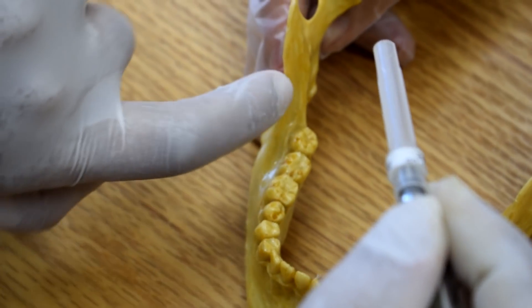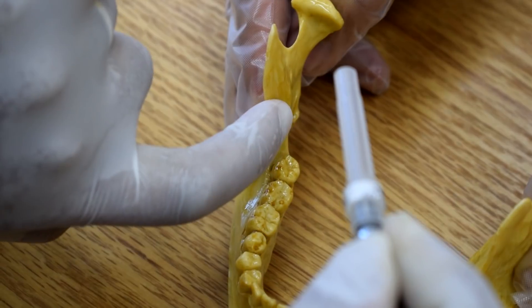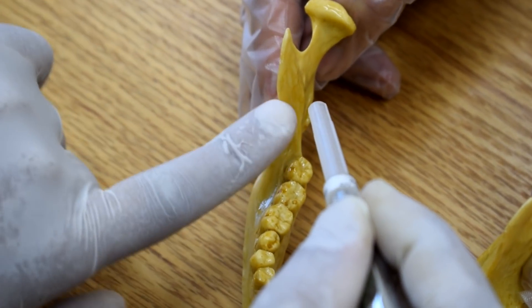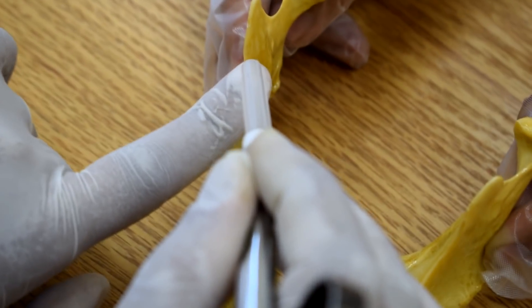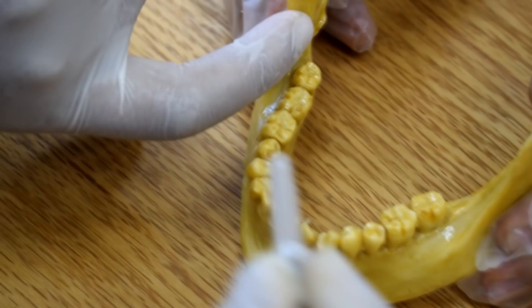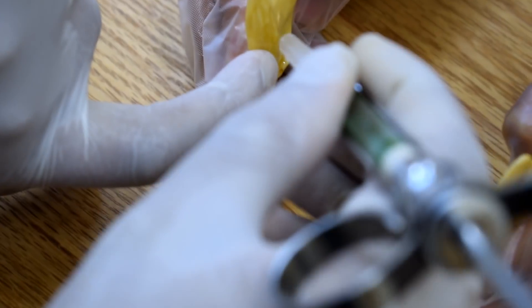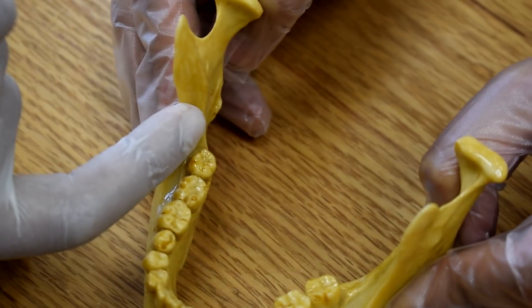If you felt only one ridge, you are wrong. You have to be in the right position. This is the most lateral area of my finger bed, feeling the external oblique ridge — here is the most concave area. I have to turn my finger immediately; I will feel the internal oblique ridge and the external oblique ridge. The pterygomandibular raphe should be like this.